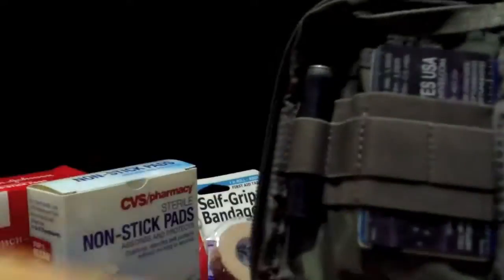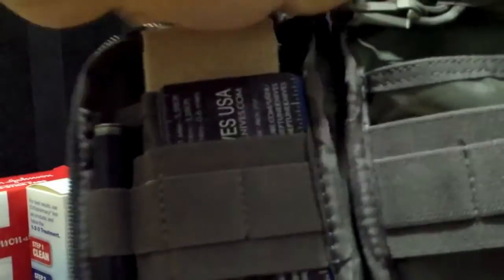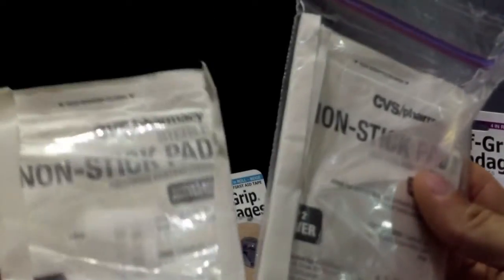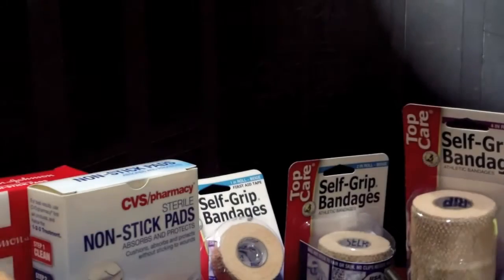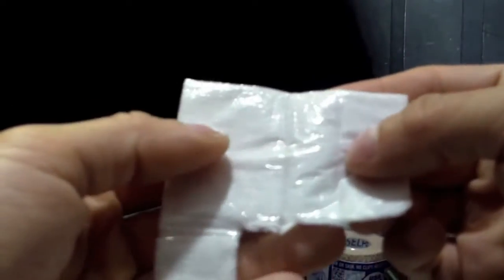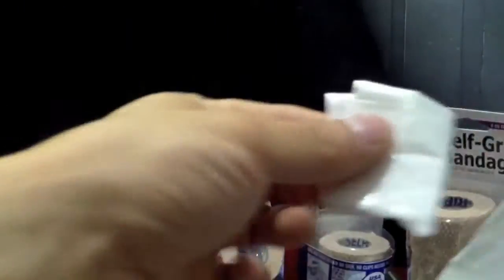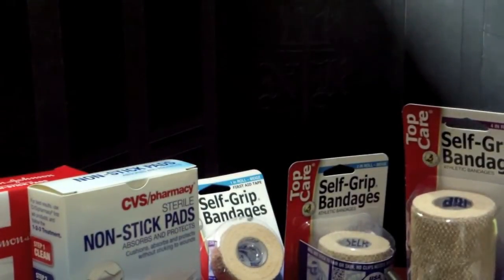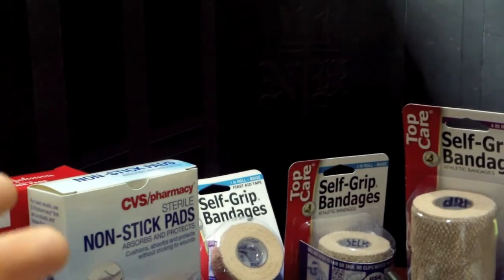But then when it comes to pressing on the wound, you can see this kit is very simple. Okay, so here we have non-stick pads. I carry a total of 3, and these are 3x4. It's very important to get non-stick, and what they look like is kind of like we see on the Band-Aid. And I've actually used this one and cut down the size, but you can see it looks like that. You can create a Band-Aid in different sizes, up to 3x4, but it's going to generally soak up very minor amounts of blood, and you have to maybe replace them.